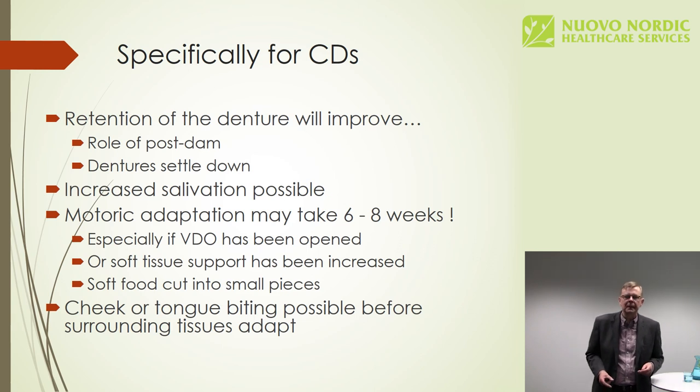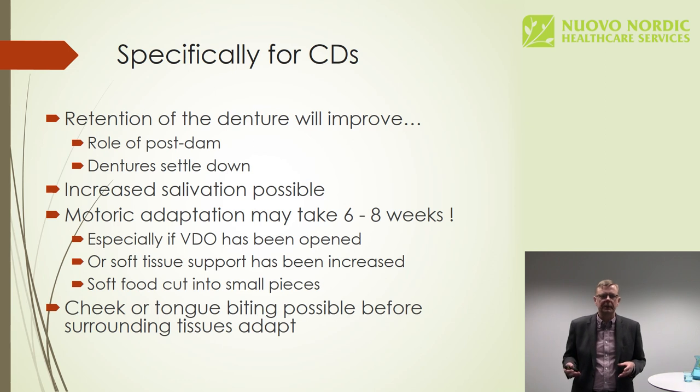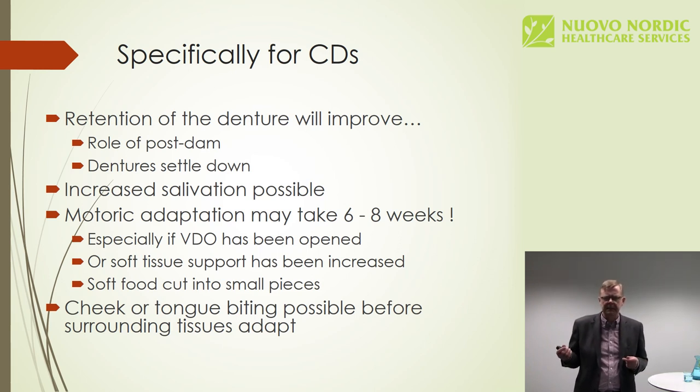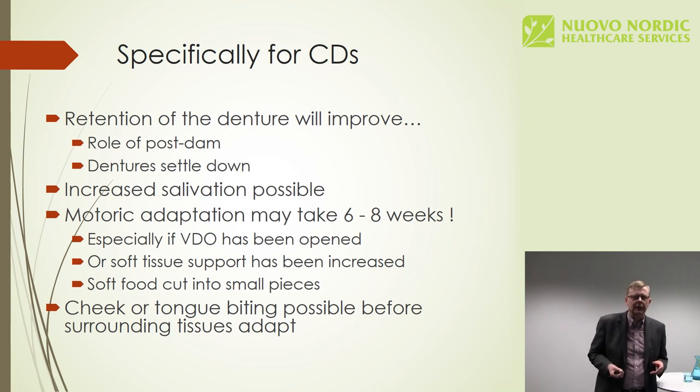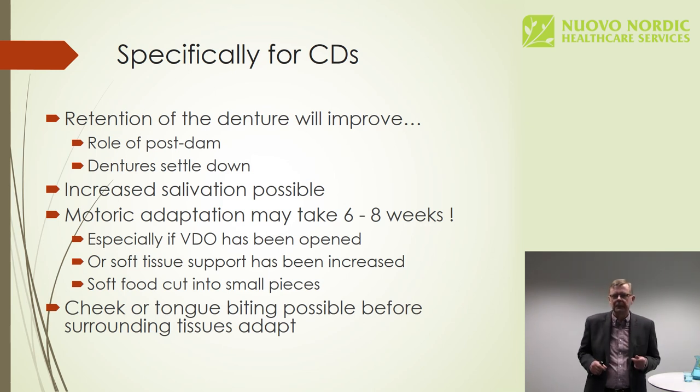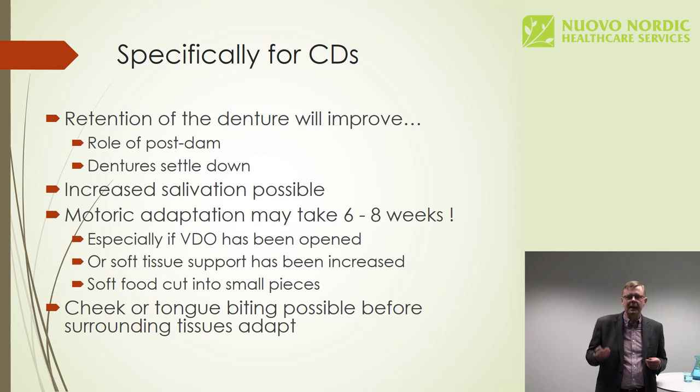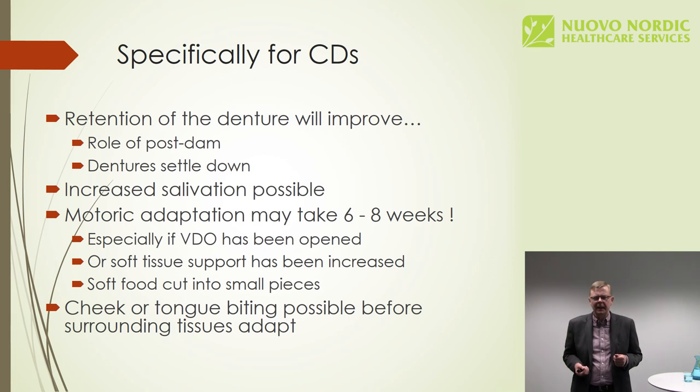Especially for the complete dentures, make sure the patient will understand that the retention of the dentures, even if it most often is very good already in the beginning, will improve over a couple of days. The posterior border, where we did the post-dam, you remember the groove on the master cast, it will make a groove on the palatal tissues as well, and as this forms, the seal will be better. With new dentures, the brain might imagine there's some food in the mouth, so salivation may be increased for a couple of days in the beginning. And in general, it will take quite a lot of time to get used to the dentures.